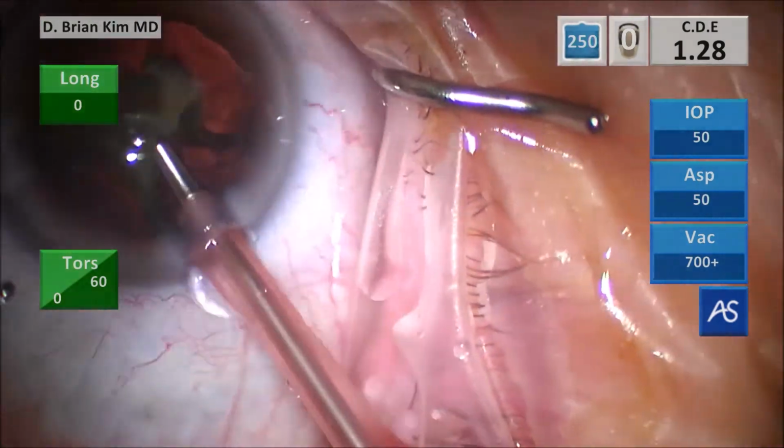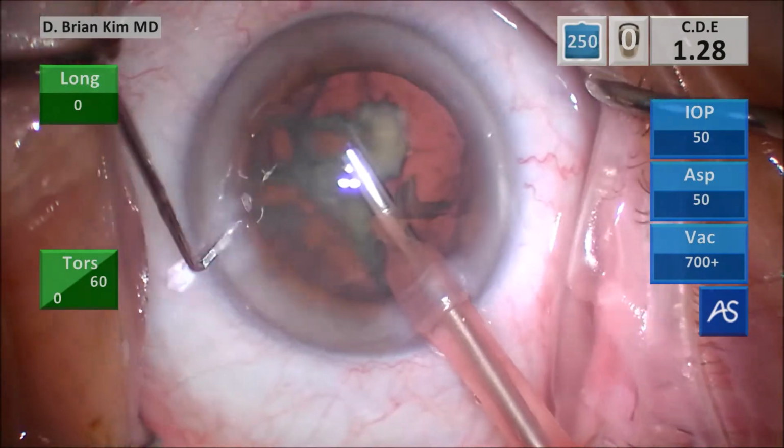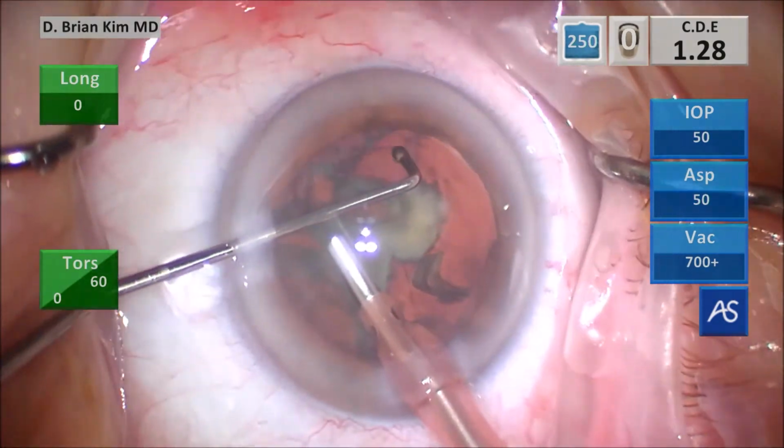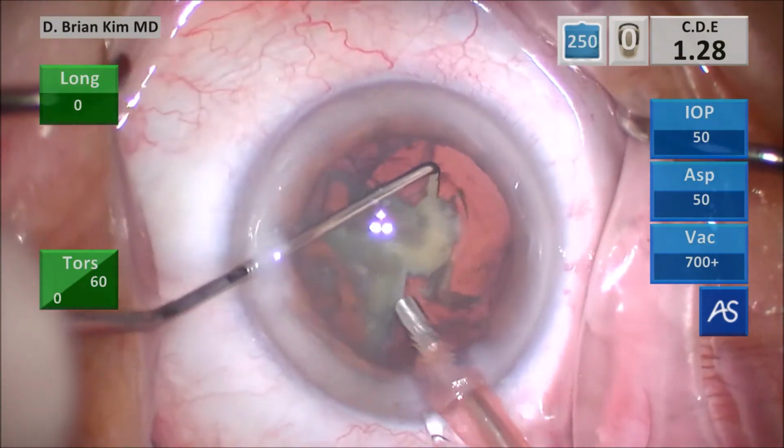I'm injecting some more dispersive viscoelastic to protect the bag. After that, I go back in with the chopper, crush that fragment to a smaller size, and then emulsify it.